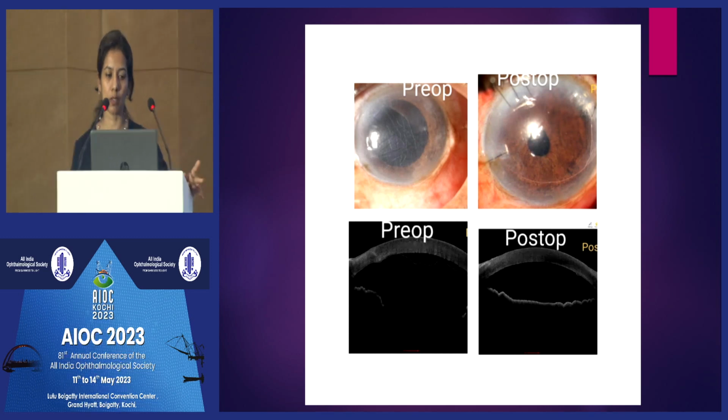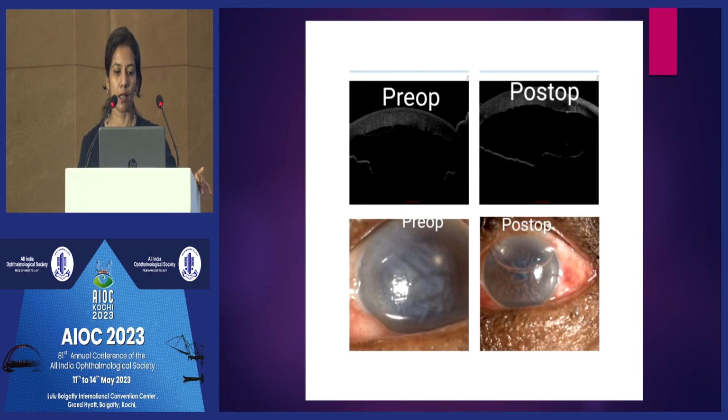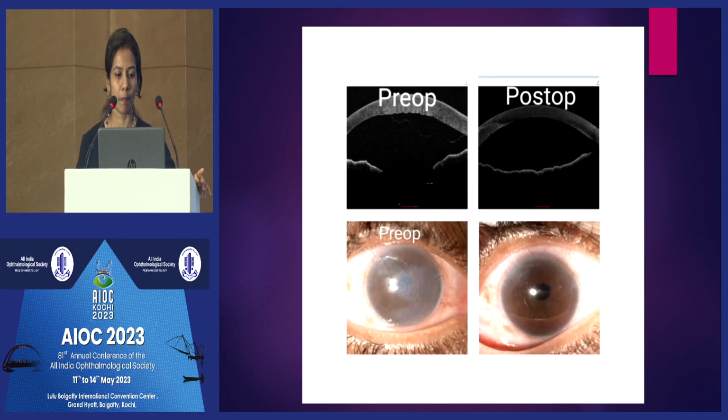And you can notice all my air injections have sutures in them, which I remove in a week's time. So this is another large rhegmatogenous detachment which we settled with air.